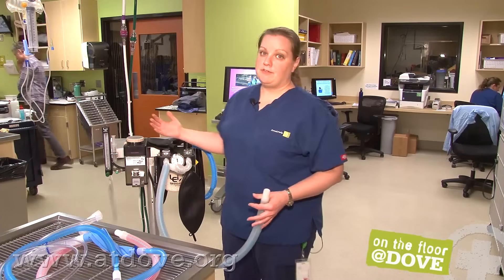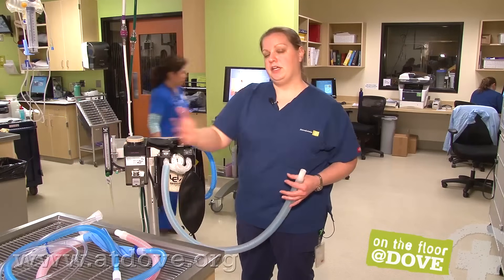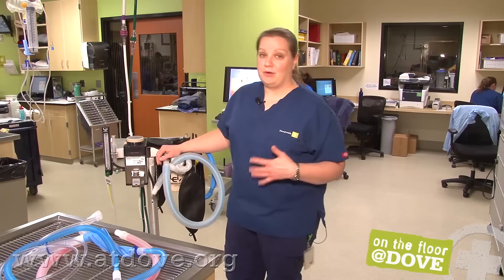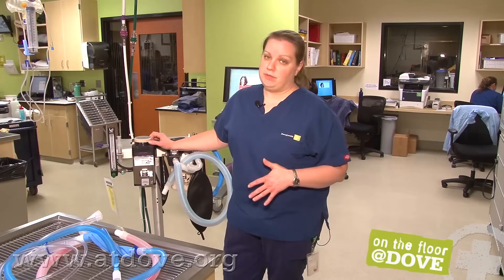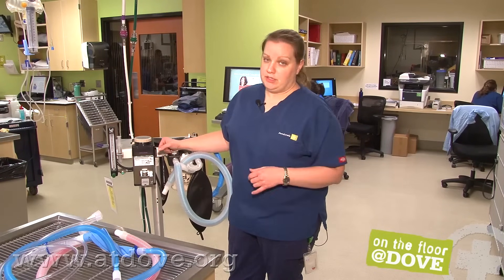In an emergency situation, you can push the flush valve, bypass your vaporizer, and give fresh oxygen to your patient. The times you'd need to do that should be minimal — it's not something you should be doing routinely, but it is available if you need it.